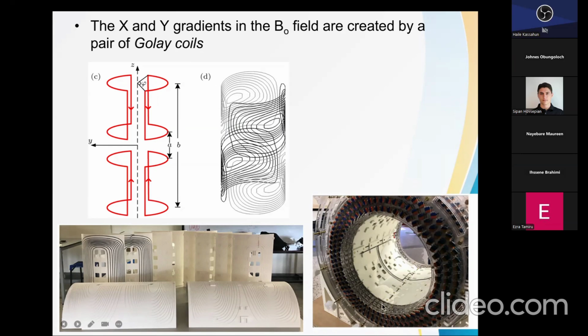If you see the magnet at the lower corner here, you can see where we have inserted our gradient magnetic fields or gradient coils. So that also starts to limit the space, the working volume within the magnet that you have constructed. So you could have aimed for 50 centimeters, but when you start putting these gradient coils in, your working volume starts to reduce, as you can imagine.